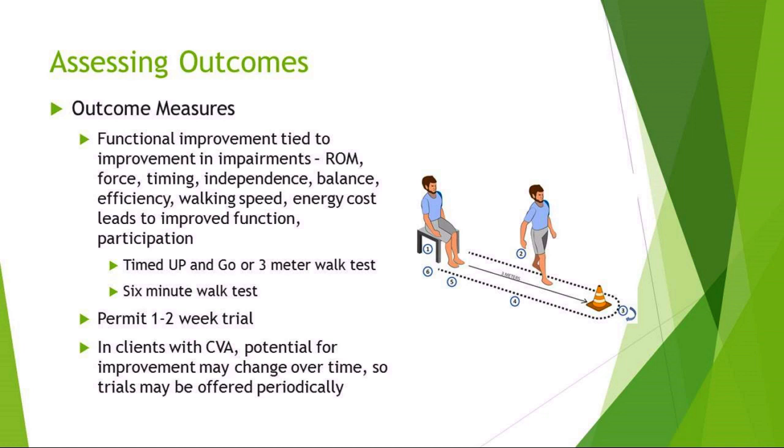And then it might work great. So I've had people doing neuromuscular electrical stim for dorsiflexion. The first time we tried it, it didn't work at all. We could not get a good dorsiflexion contraction. But a few weeks or a few months later, we tried it again and it worked great. So you might periodically offer a trial of that device. You go, okay, it didn't work last time, but let's try it again now that you've had more time to heal and incorporate these challenges into your life.